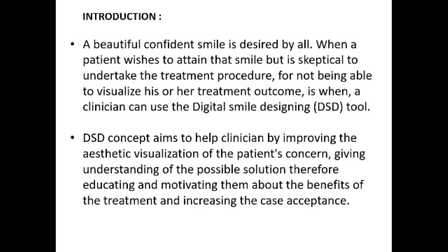If the patient walks in with a problem, the clinician will be able to show different types of treatment protocols without even touching the patient. We can just take the videographs and photographs of the patient, and with the help of the software and other tools like CBCT, etc., we can come up with the final digital outcome. With that, the patient will feel confident and be able to actively participate in the treatment plan, and the final end result will be much more satisfying for the patient as well as the clinician.